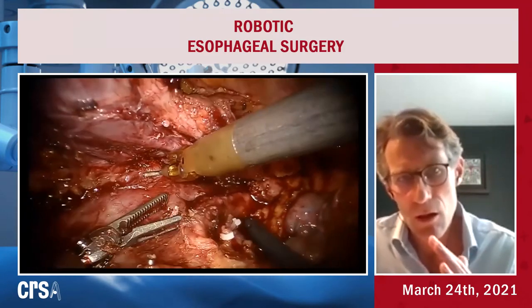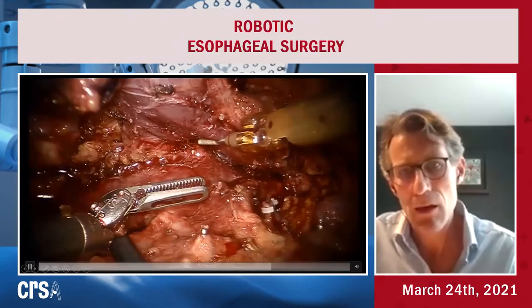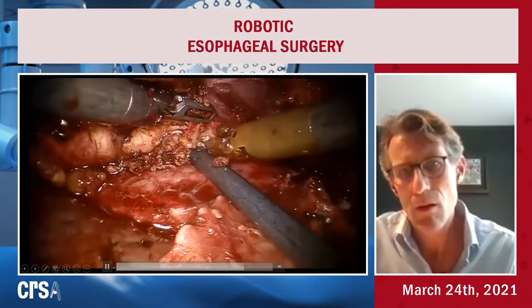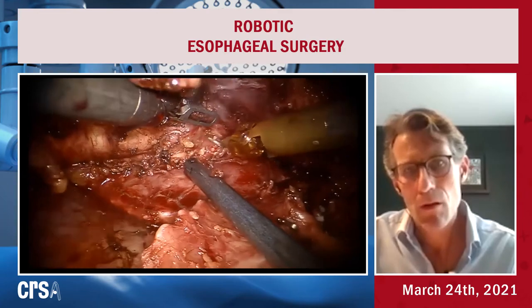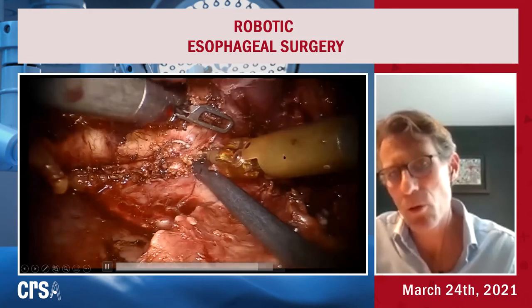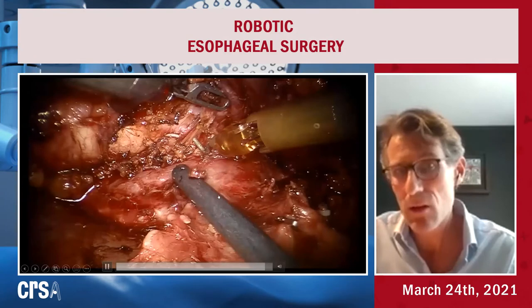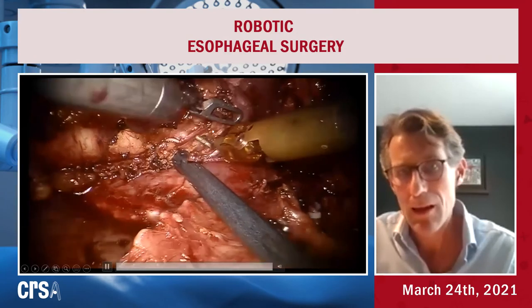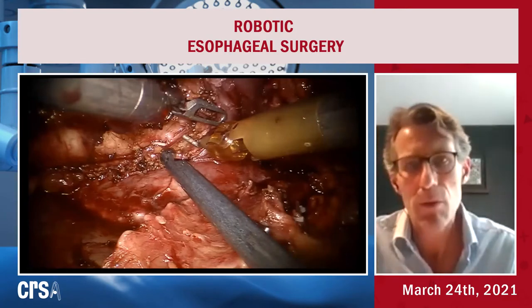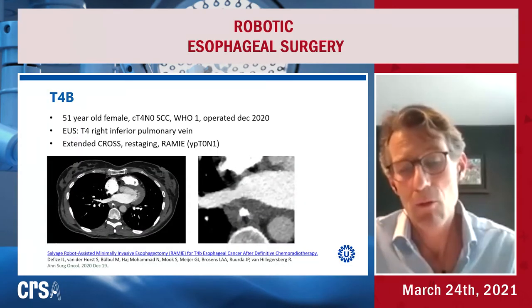T4 tumors on the trachea are usually squamous and respond pretty well to chemoradiotherapy. Usually they're also fixed on the aorta at the same spot, which makes it difficult because they don't lift easily. You have to be very gentle and go step by step. That was the first example.